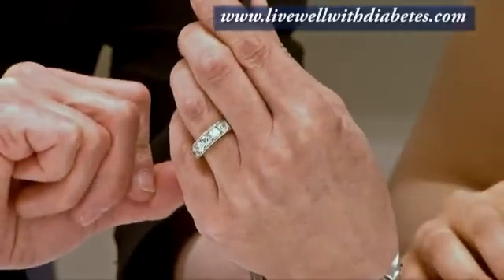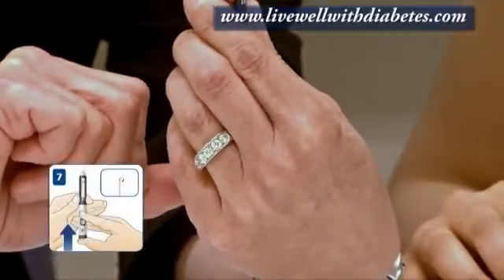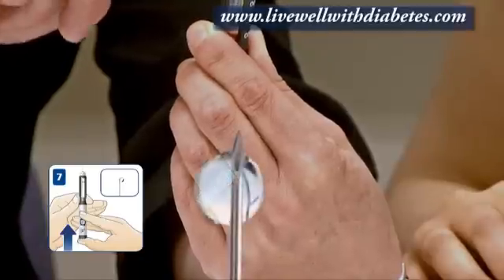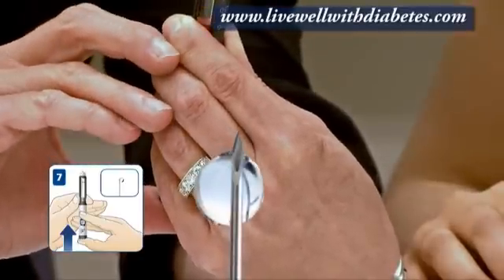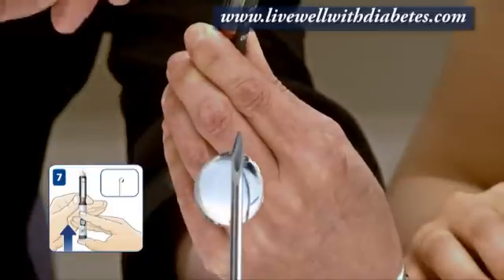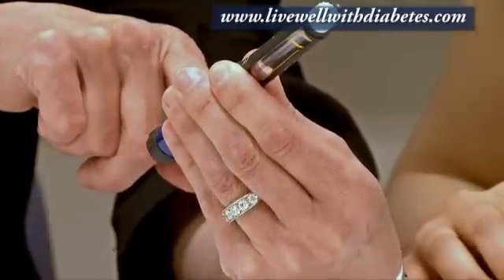You push the button on the end, and when you push it in all the way, this is going to turn to zero, but you're also going to see some insulin come out. When you push this button up, you see the insulin come out, and this has gone back to zero again.